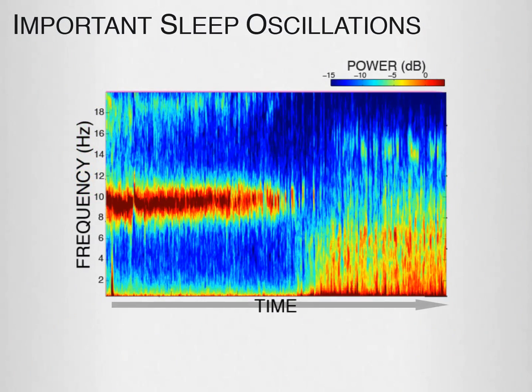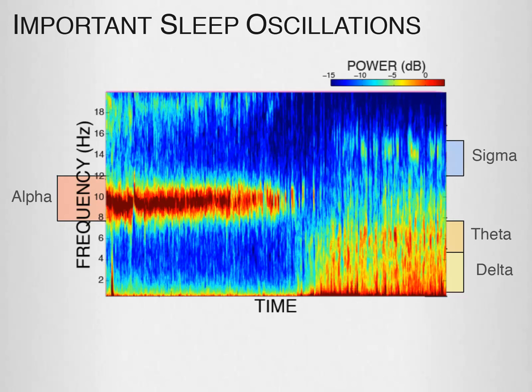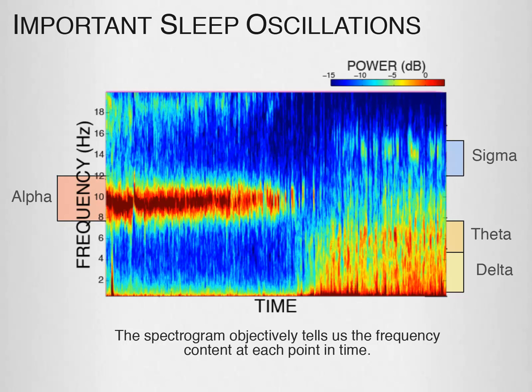In the spectrogram, the x-axis is time, the y-axis is frequency measured in hertz, and the color is power. Whereas in traditional time domain scoring we look for an 8-12 Hz oscillation in the waveforms to indicate the presence of alpha waves, the spectrogram reveals a strong band of power in the 8-12 Hz range. Likewise, power in other bands such as delta, theta, and sigma can be determined in the spectrogram. While it takes skill and guesswork to accurately identify a particular frequency by eye within an EEG waveform, the spectrogram objectively tells us the frequency content at each point in time.